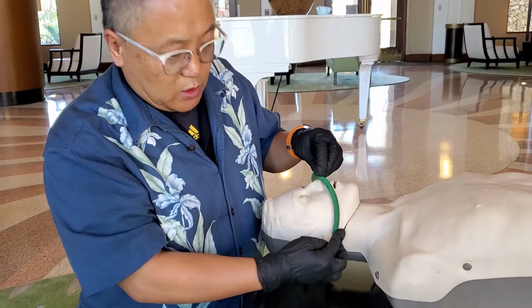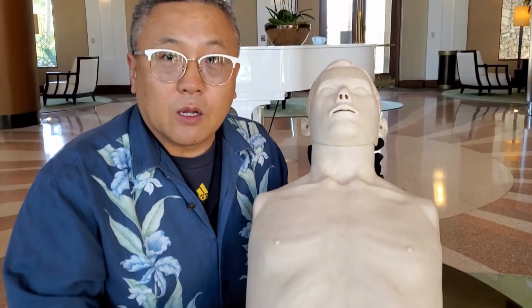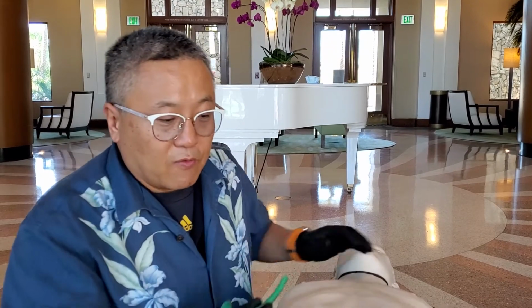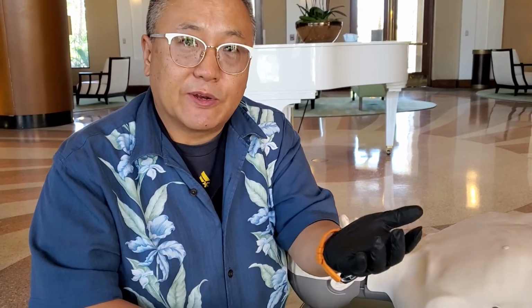Tip of the nose, earlobe, like this. Before you put it in the nose, we have to use water-soluble lubricant, okay? Water-soluble lubricant.